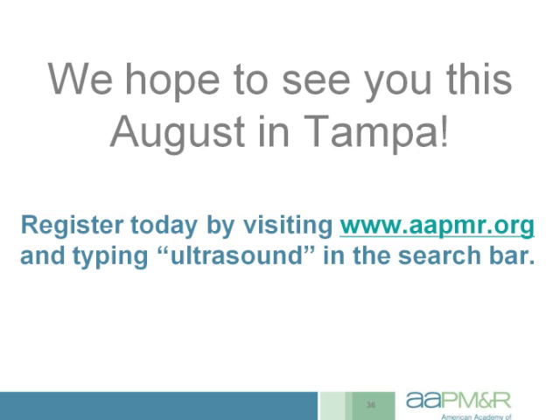And I have to say I felt a little bit that way myself before I started doing some trigger point injections under ultrasound, but I've really found that to be a useful tool in my practice. I would say the minority of the time I'm using ultrasound for trigger points, but if you're dealing with an area, particularly the cervical spine, where there's a lot of high-priced real estate, sometimes it's very reassuring for both the physician and the patient to be able to follow that needle live in real time through all the tissue layers.